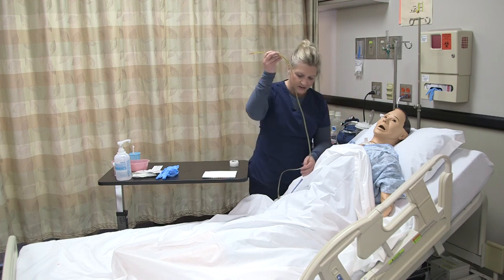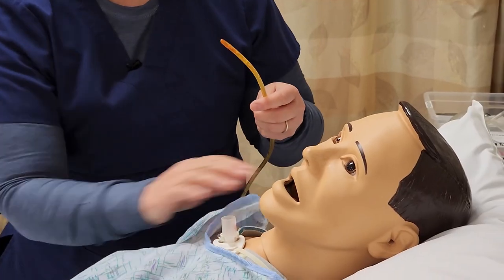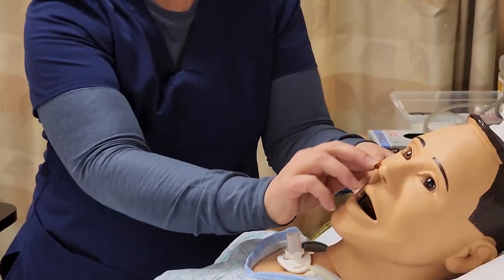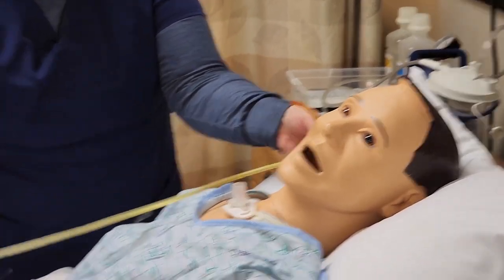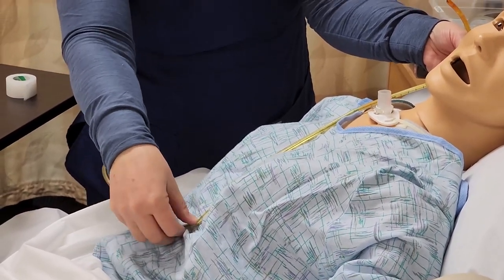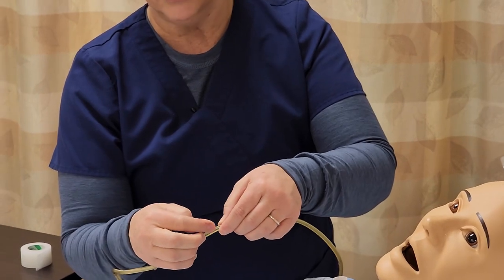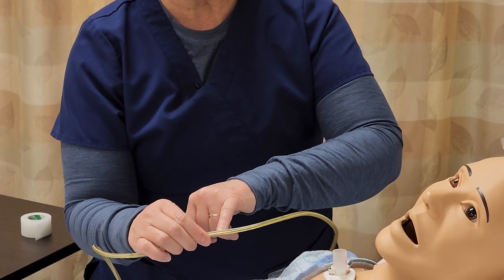I'm going to measure how far I should insert this into the patient. Typically, the exit point of the tube is placed at the nares, then to the earlobe, and then guided down to the xiphoid process, going between the umbilicus and the xiphoid process — that is the point to which you will insert the tube. You either want to mark it, tape it, or remember the reading on the tube. For this patient, it would be around 54.